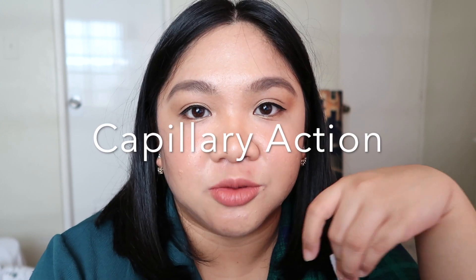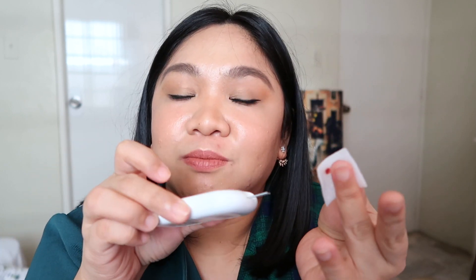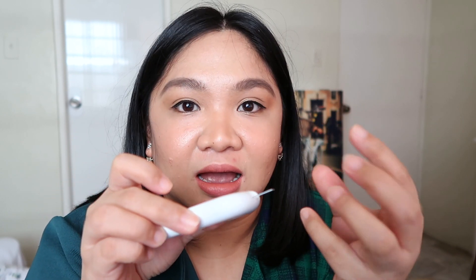I'm done. Now for the tip on drawing blood: the test strips have capillary action, meaning they will suck the blood from the puncture site. You don't actually need to drip the blood onto the strip — just touch the tip of the blood bubble to the tip of the test strip and it will absorb it on its own.